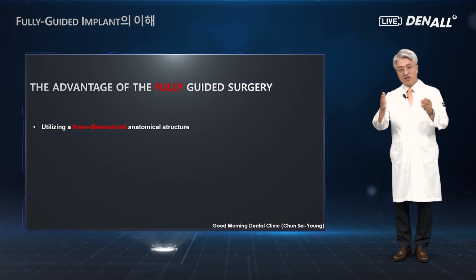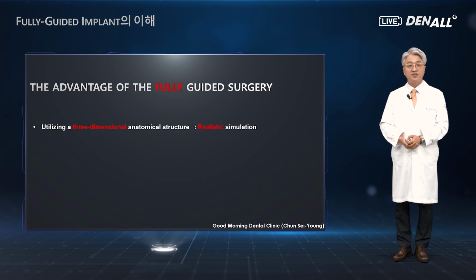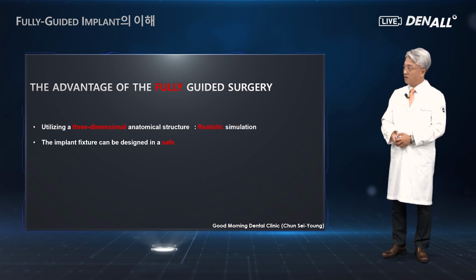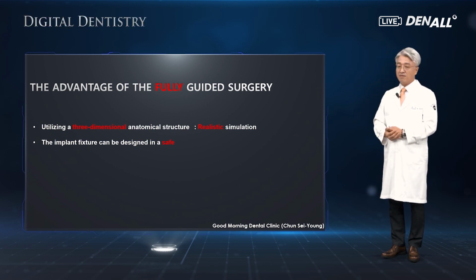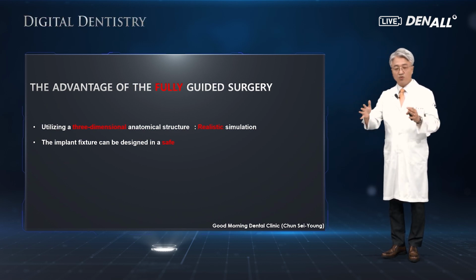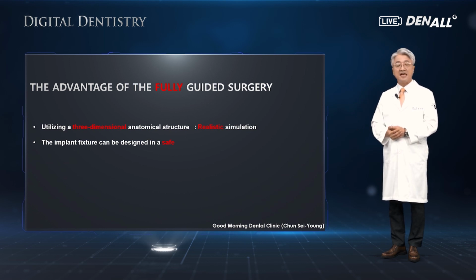So using the three-dimensional anatomical structure is a big advantage. The implant fixture can be designed in a safe place, in safe positions.